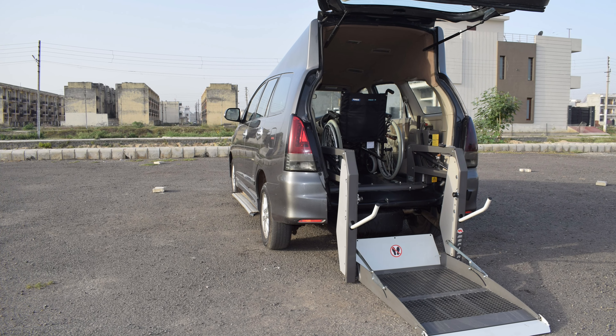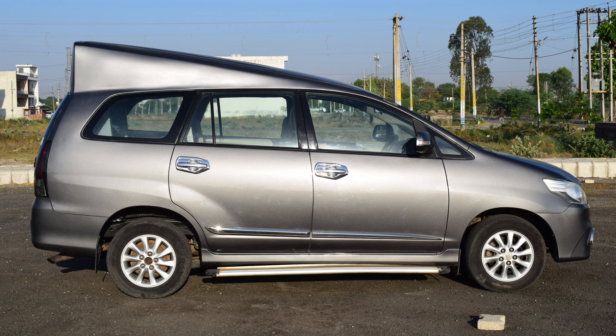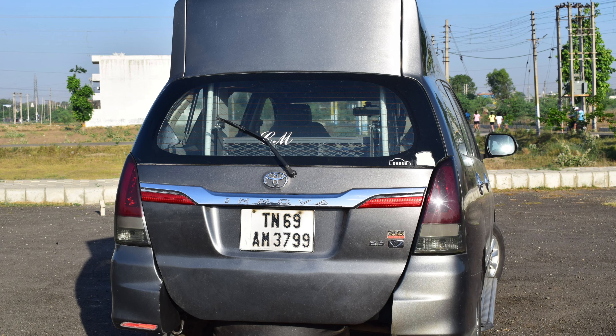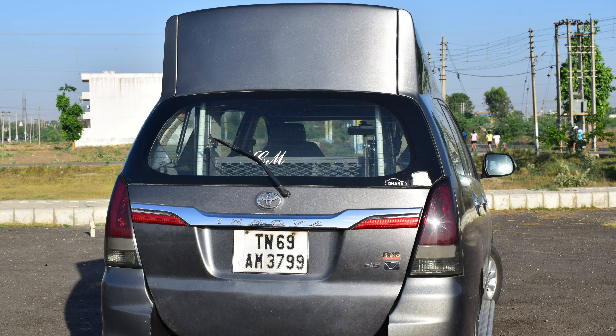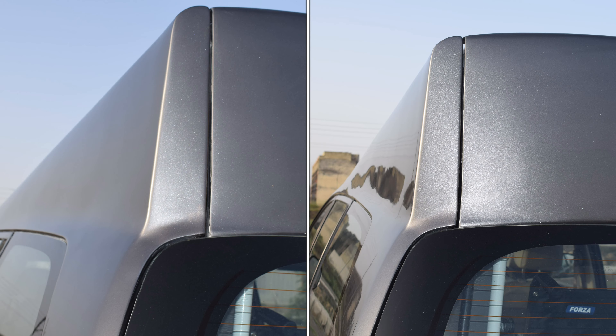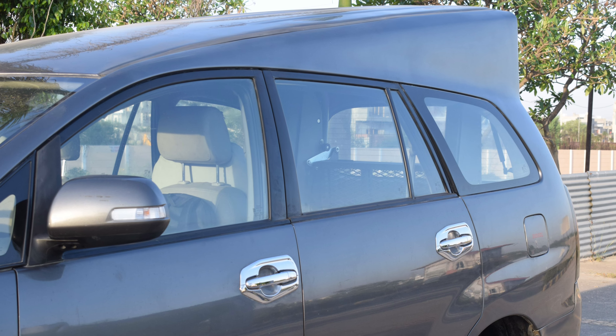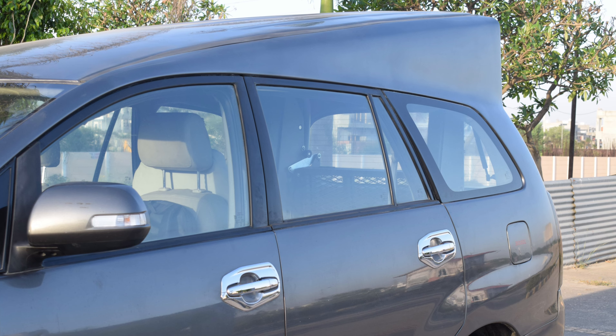Lastly, let's acknowledge the most extensive work and lifeline of this whole project — the fabrication work on this Innova, without which none of this would have been possible. To accommodate the wheelchair user in the car we had to increase the height of the car as well as level the floor and bring it down as much as possible. Considering all the aerodynamics of the car, we designed the shape of the roof which cuts the air very well and causes no issues while driving even after increasing the vehicle height. That distinguishes us from other fabricators in the field — our work is top notch in quality and affordable to all.